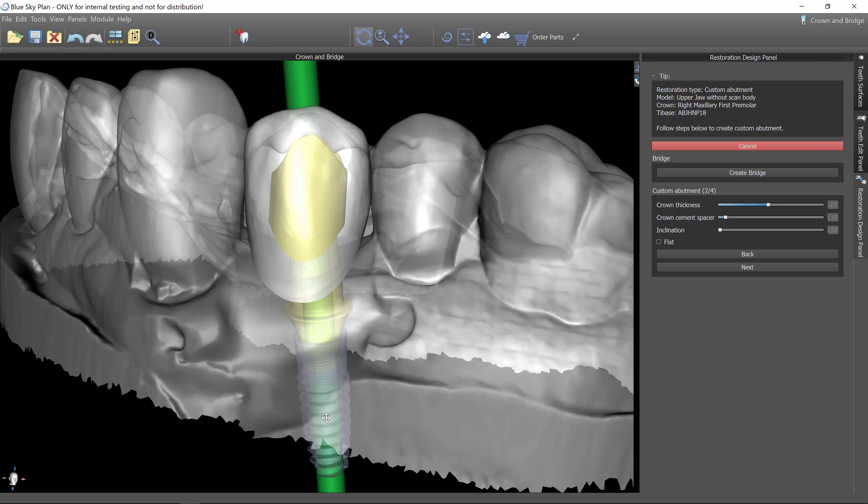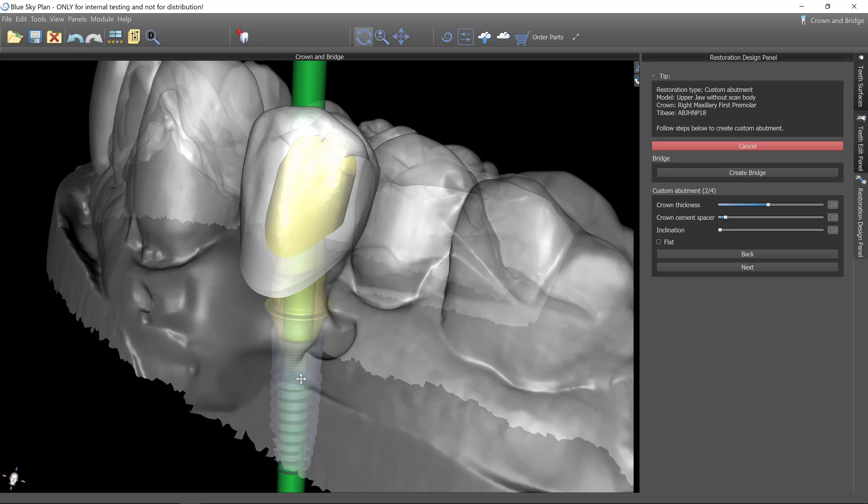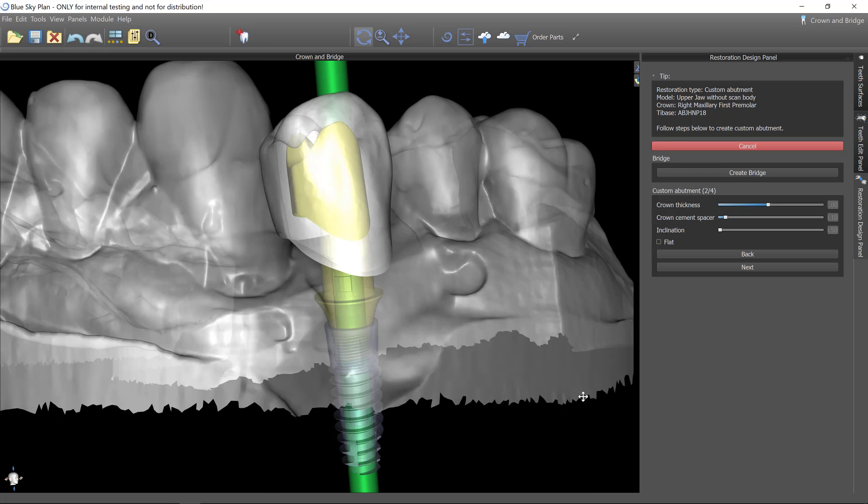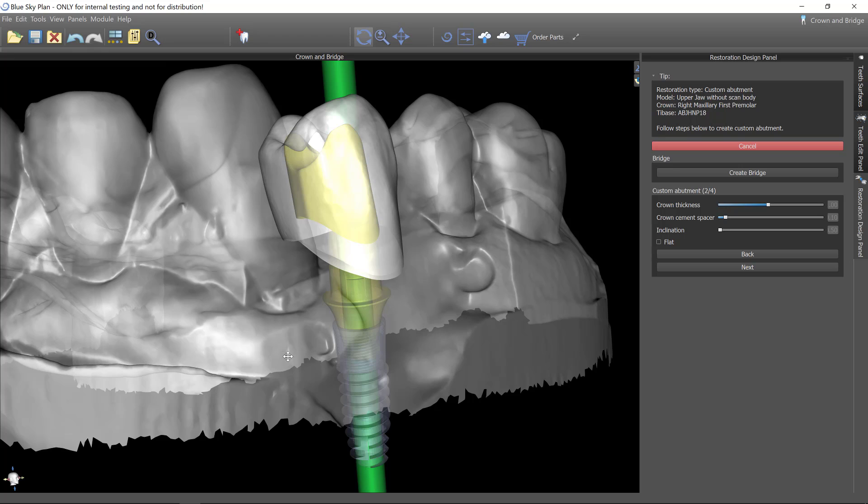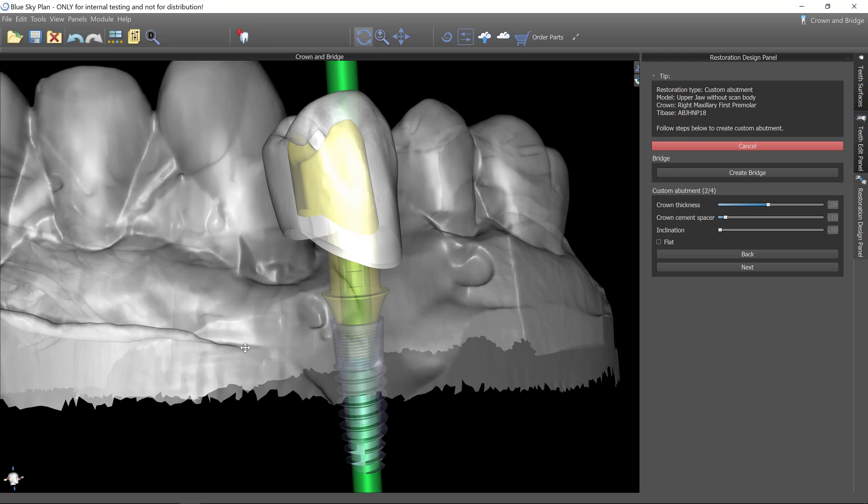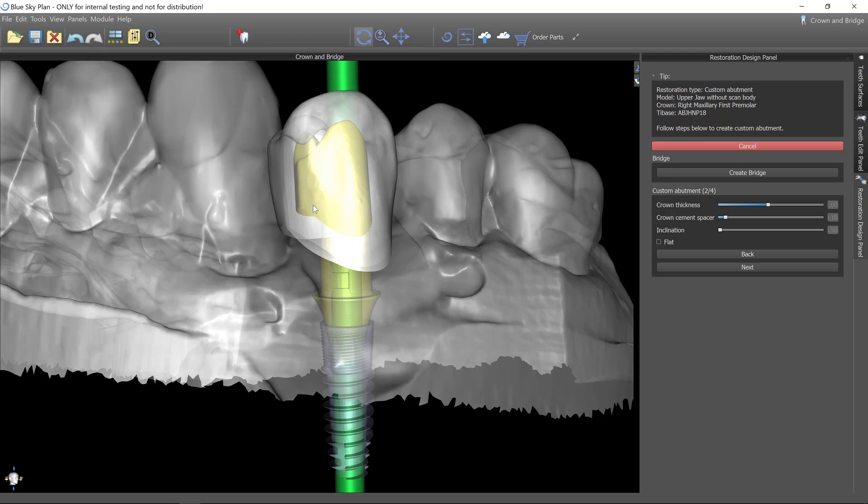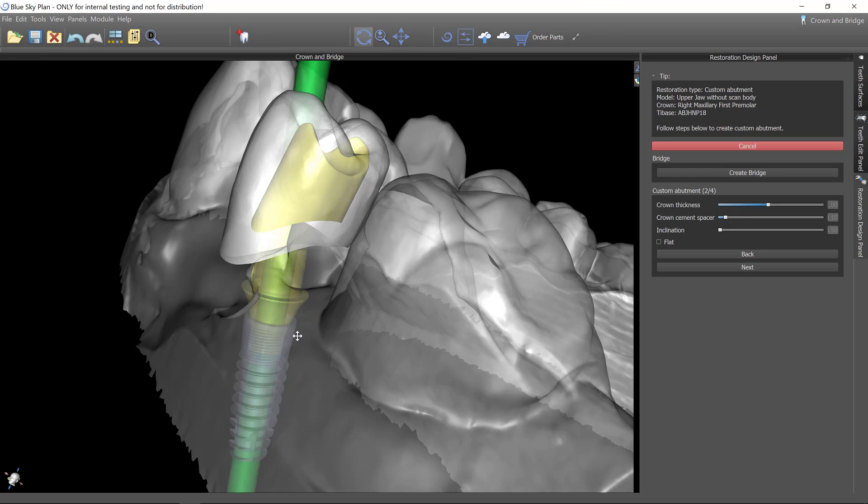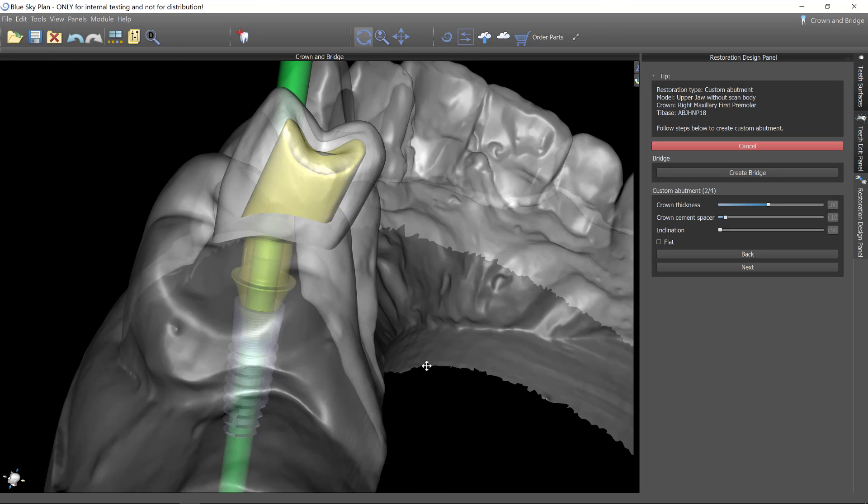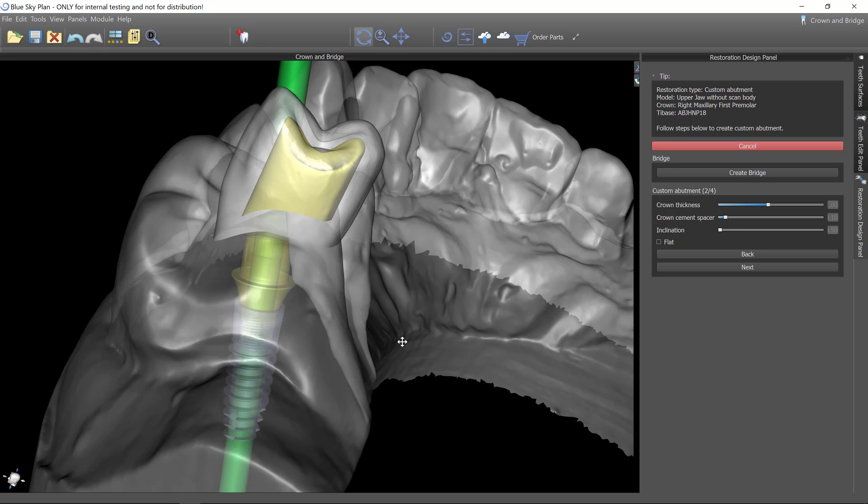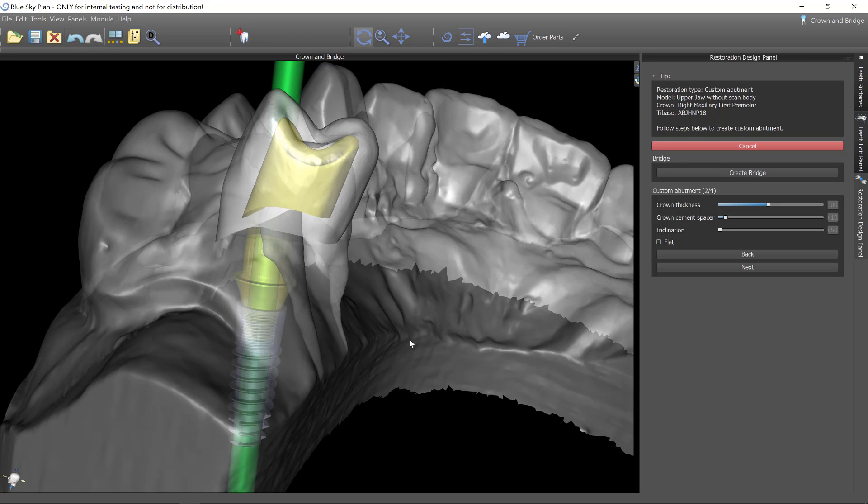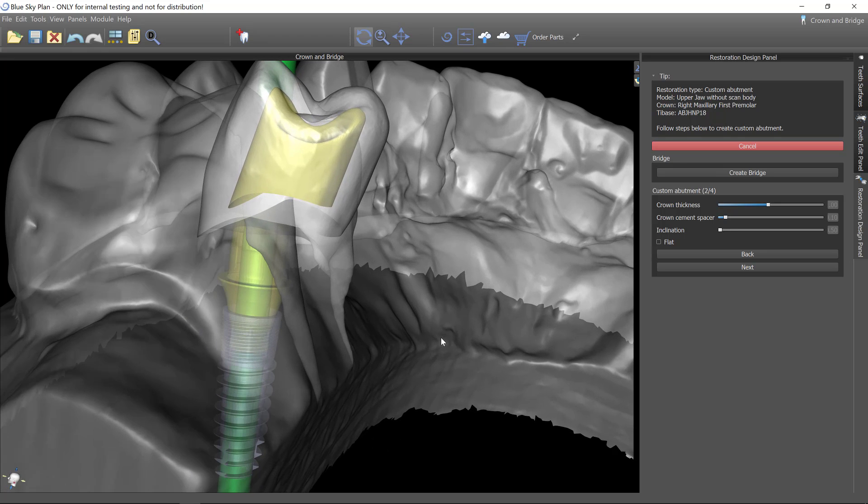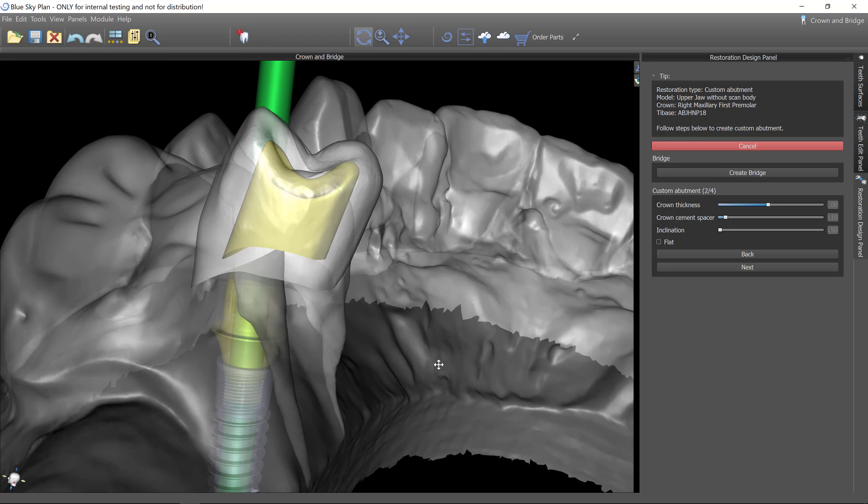Okay, so here we see the abutment or at least the start of the abutment. So it's not going to show you the transition zone. This is just the axial walls and the occlusal portion of this.